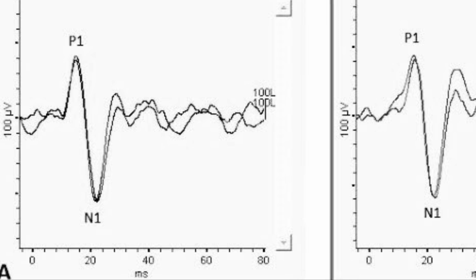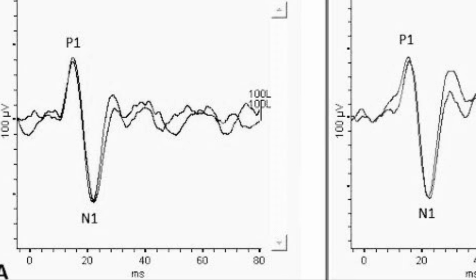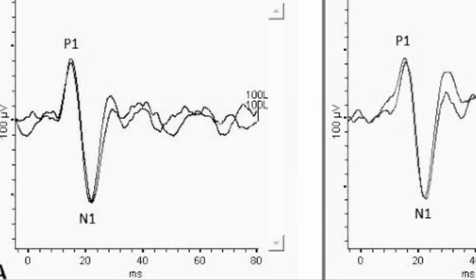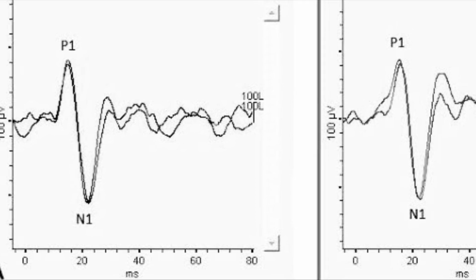To summarize, VEMPs are non-invasive, stimulus-specific tests that help distinguish between utricular and saccular dysfunction, enhancing diagnostic precision for various vestibular conditions. Their utility continues to evolve as new recording techniques and stimuli are explored.